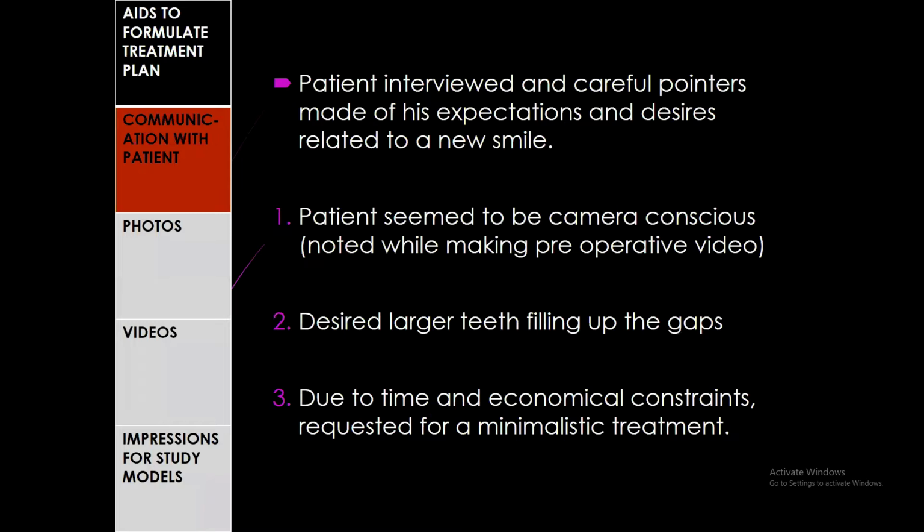When we communicated with the patient, he was interviewed and careful pointers were made of his expectations and desires related to a new smile. The patient seemed to be camera conscious, which was noted while making the preoperative video. He desired larger teeth filling up the gaps, and due to time and economic constraints, he requested a minimalistic treatment.